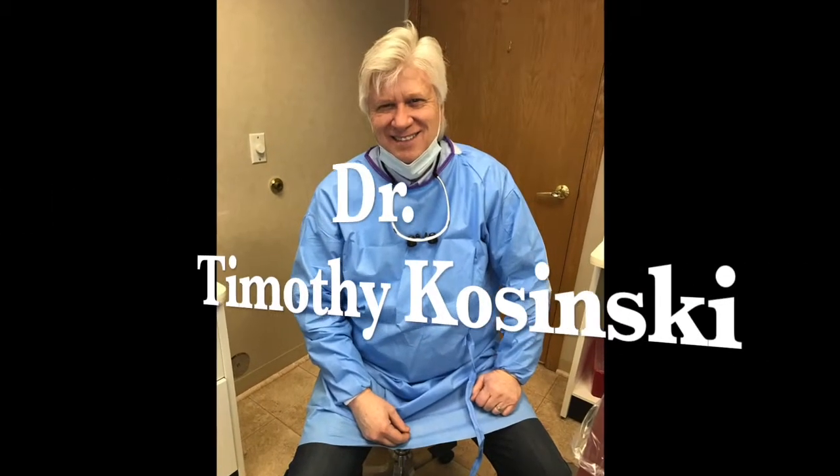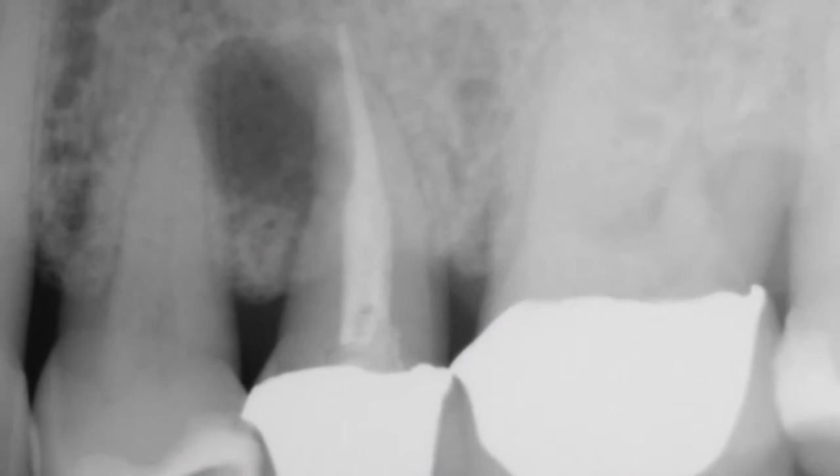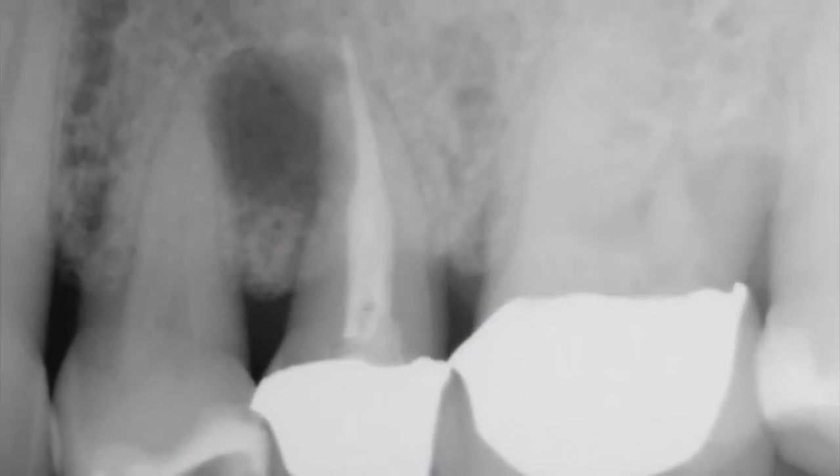Hi, I'm Dr. Tim Kaczynski, and today we're going to demonstrate an atraumatic extraction of a non-restorable bicuspid tooth.